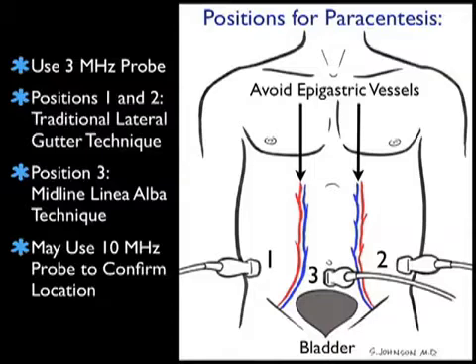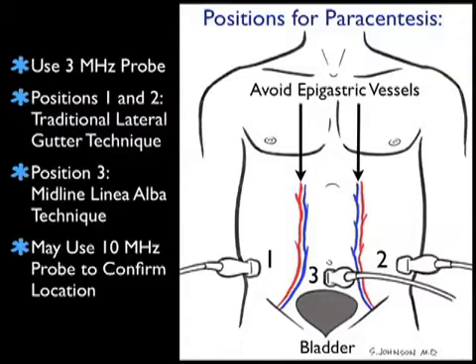This would be above the anterior superior iliac crests, and we can look for fluid within the lateral gutters and plan for a puncture attempt in either of these positions. We can also place the probe in probe position three, the midline linea alba position, below the umbilicus in the relatively avascular midline linea alba.